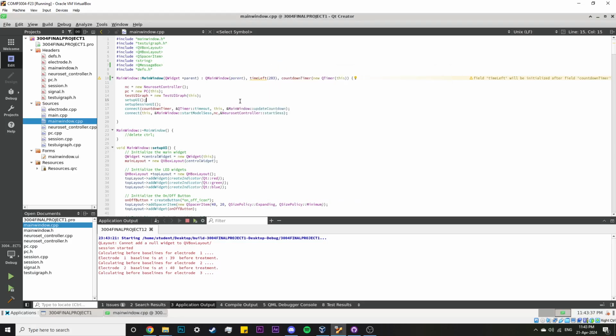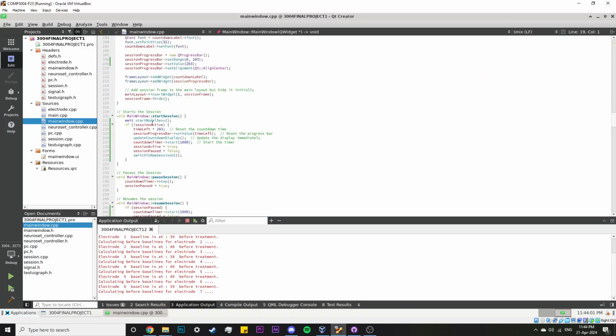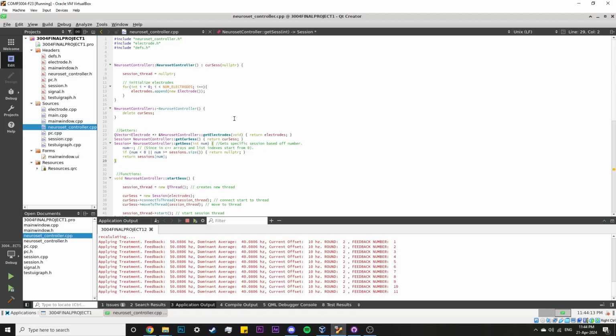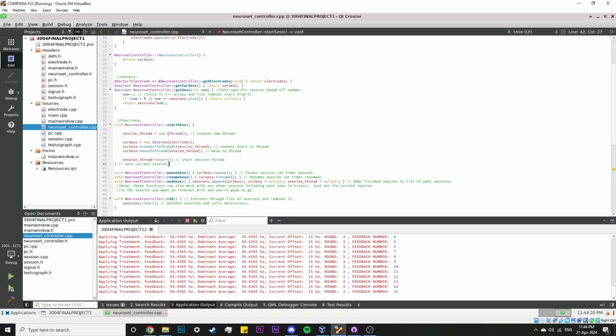Alright, so we'll just have this running in the back, and meanwhile we'll explain the Neuroset connection first. In the start session function, it emits the start model session signal, which is connected to the Neuroset controller. If you could go to neurosetcontroller.cpp, it is connected to the start session function. That creates a new thread for the session thread. It creates a new session for the current session. It connects the start function of the session to the session thread, and then it moves the current session to that thread, and then it starts that session thread.